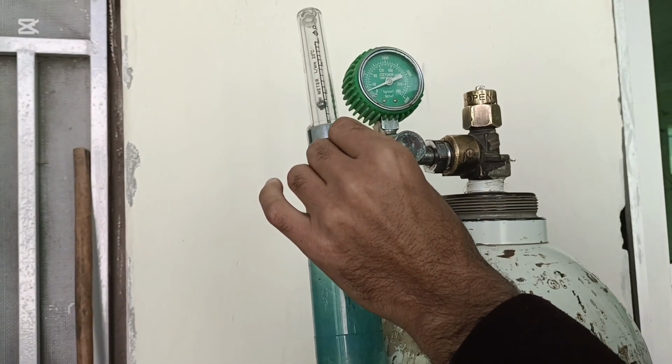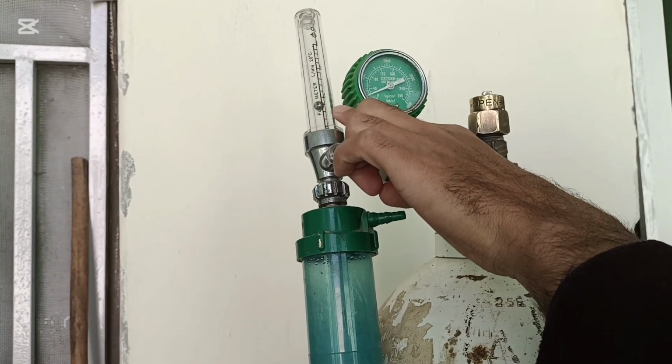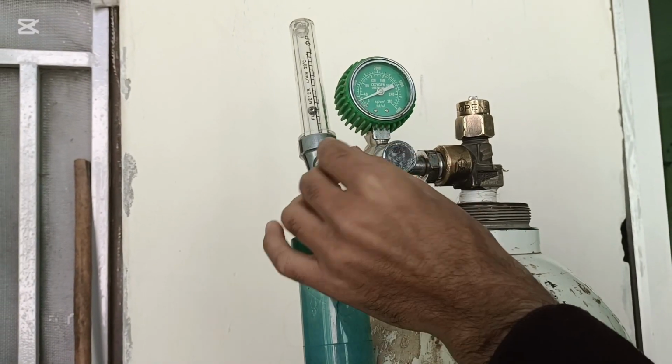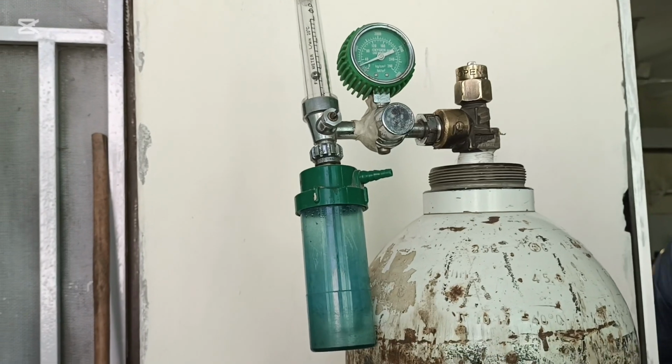When this flow starts, you will see a ball-like material inside the glass tube. So whatever amount of oxygen you want to deliver to the patient, you can set it from the control valve. So this was all about how to set the oxygen regulator.